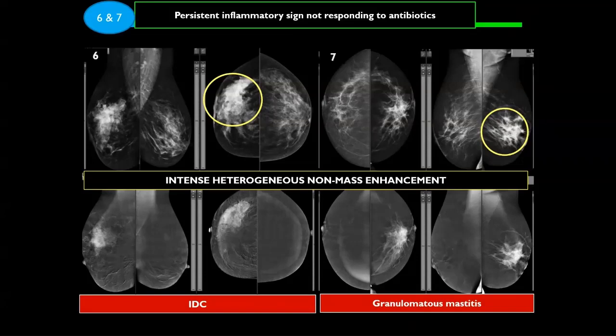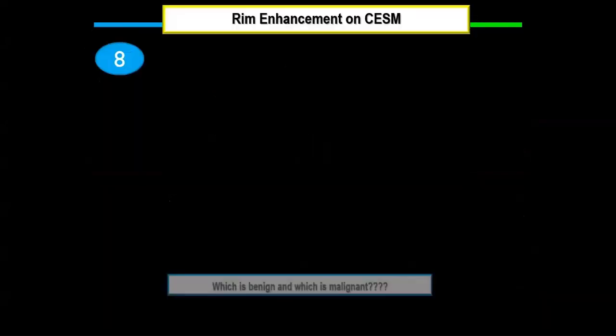But if you have the patient diagnosed and you just want to monitor her treatment, it's okay. You can perform a contrast mammogram just to see, because it is much easier than monitoring the treatment using MRI.